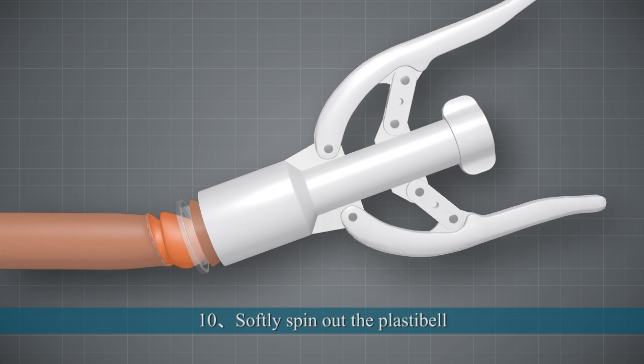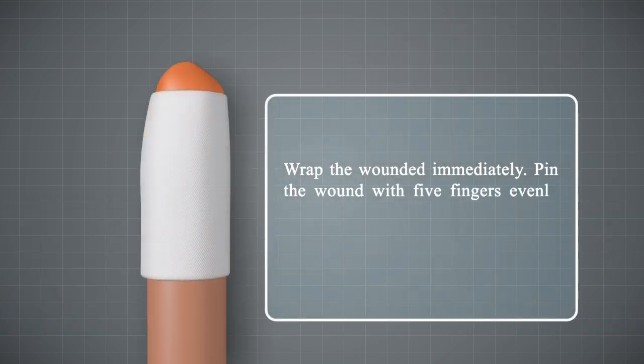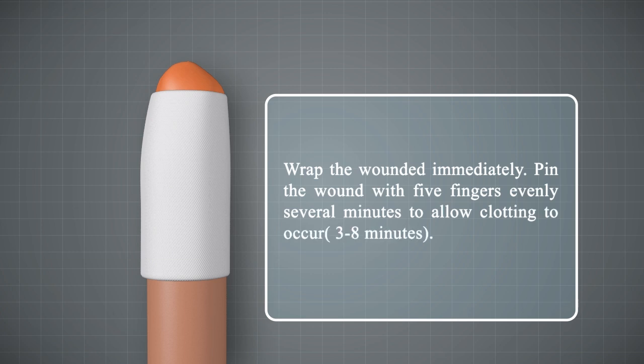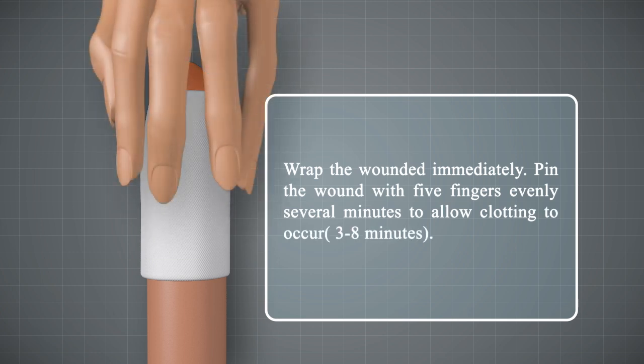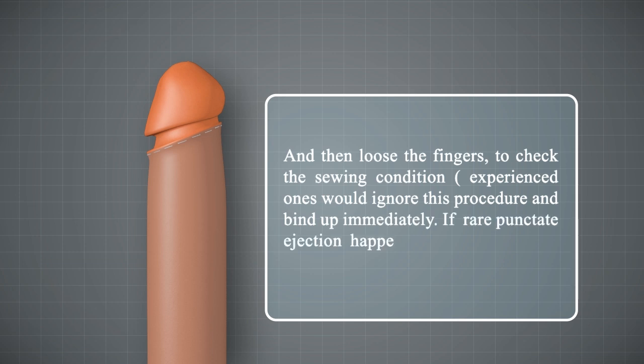10. Gently spin out the Plastic Bell and wrap the wound immediately. Press the wound with five fingers evenly for 3–8 minutes to allow clotting to occur, then loosen the fingers to check the stapling condition.